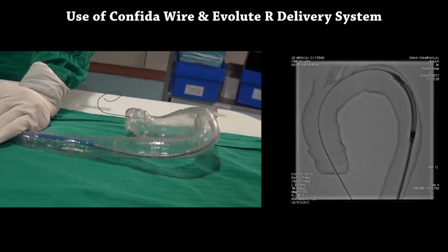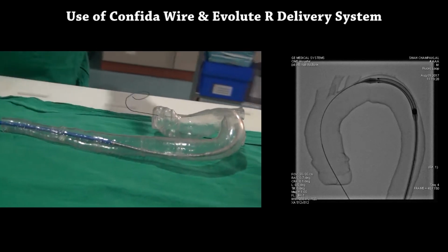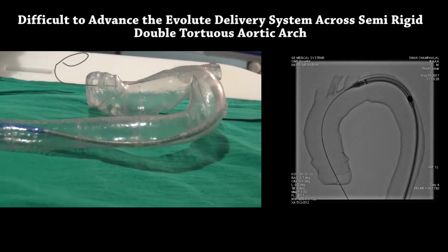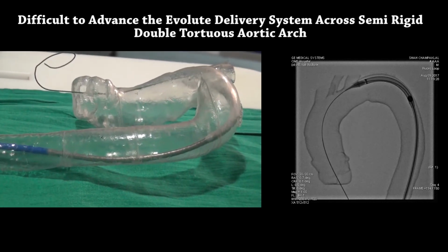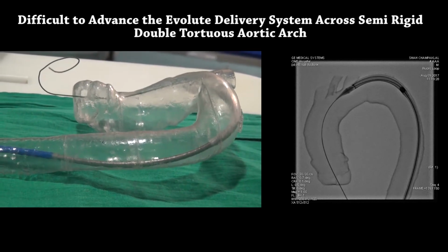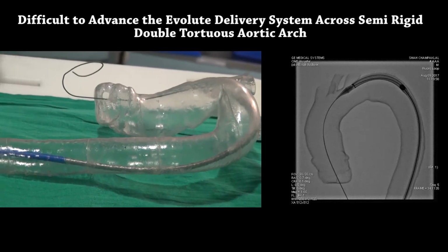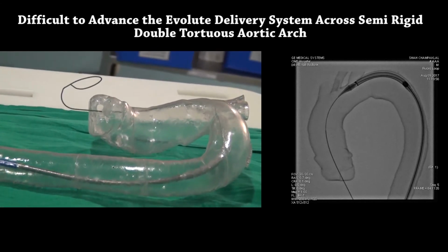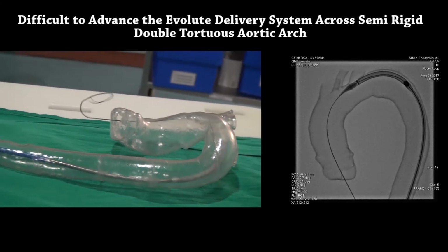We first used a regular wire and we found very difficulty with the implant stiff wire, so we decided to use a Confida wire. With the Medtronic Confida wire, you can see we still had difficulty to advance the Evolut delivery system across the double tortuous aortic arch.